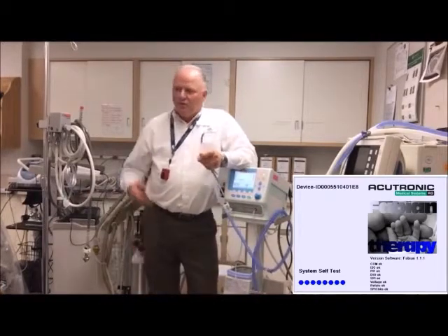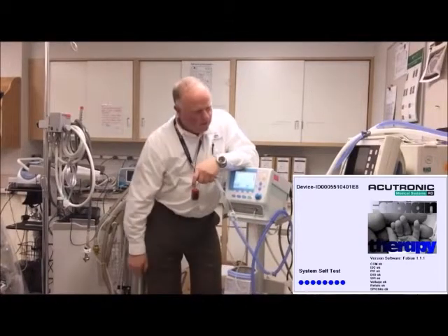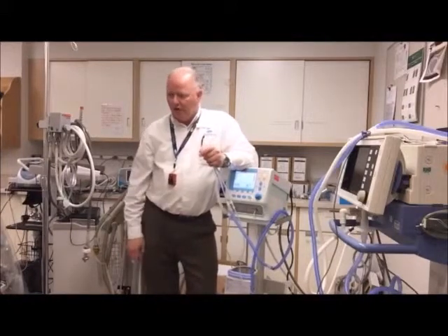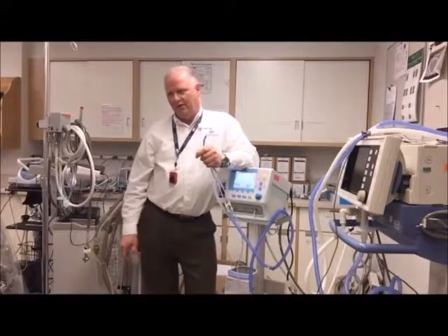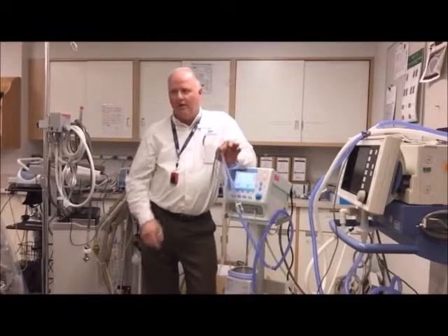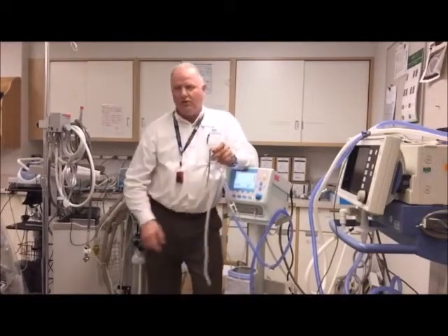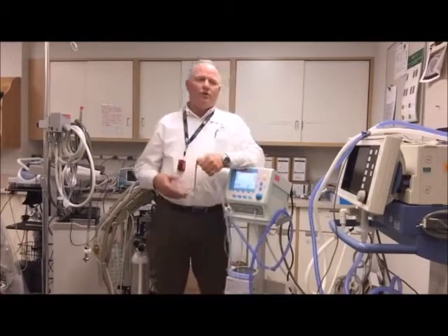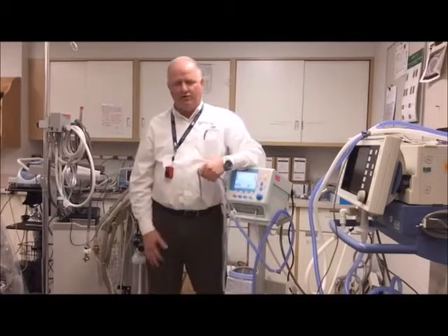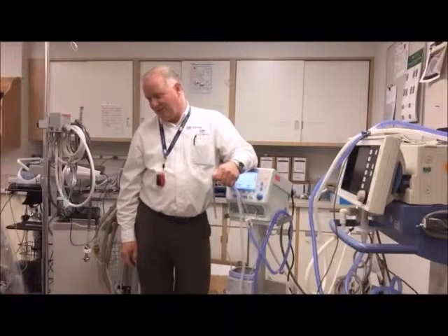In standby mode, you can turn on your heated circuit or heated chamber while waiting for the baby, without having four liters of continuous flow going through and superheating the water. When the baby's ready, you turn it on and you don't have to worry about scorching them, or about a cold humidifier pot going into your fragile little baby. That's a nice feature.